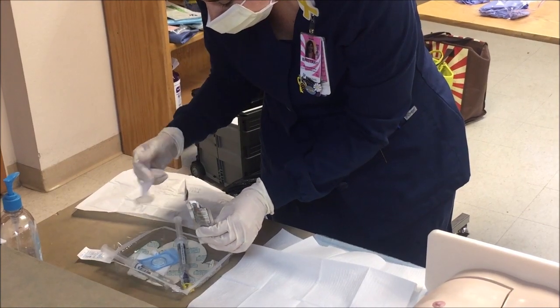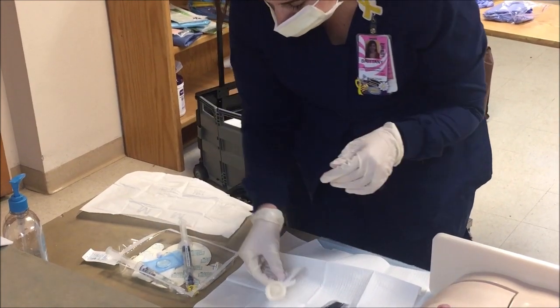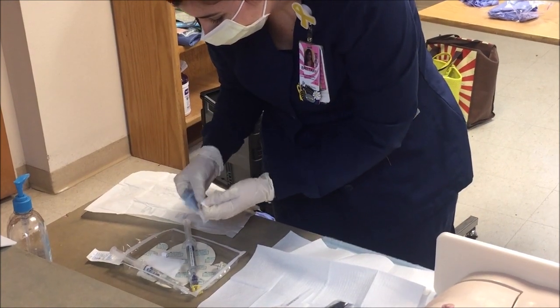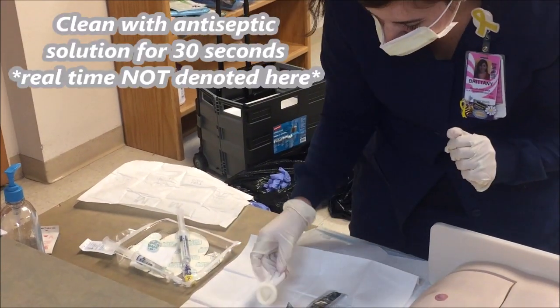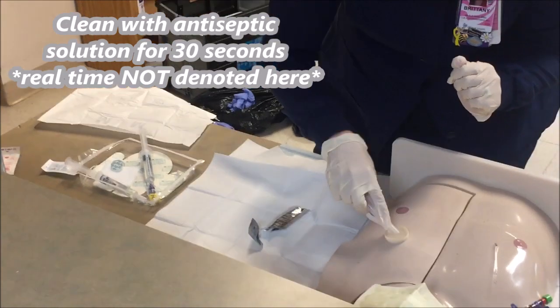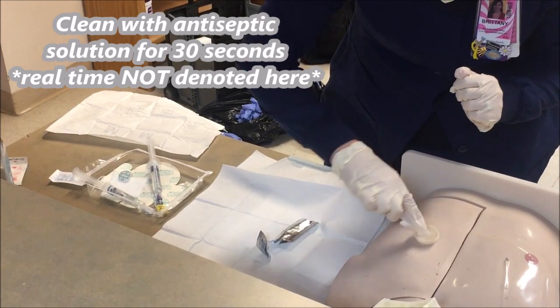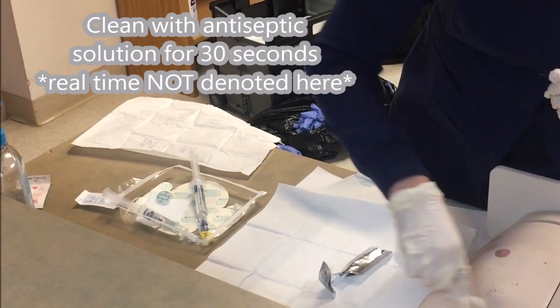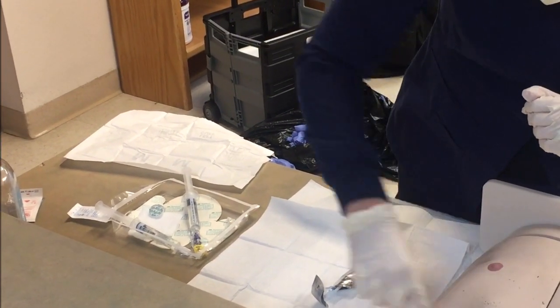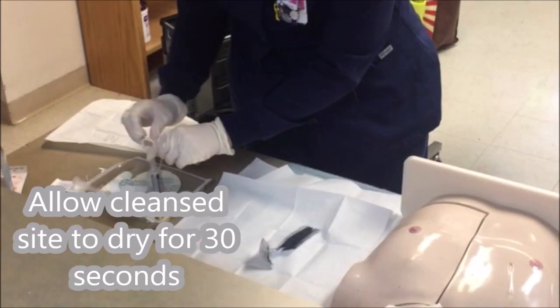Open your adhesive prep and set it to the side on your sterile field. Open your antiseptic cleaning solution by popping the sides, squeezing them together and shaking, causing the antiseptic solution to flow into the softer part. Scrub the skin for 30 seconds using a vigorous back-and-forth motion to help kill the germs. While the skin is wet the germs are inactive, but in order for the germs to die, the skin must dry. Do not fan or blow on the skin — it needs to air dry for 30 seconds.